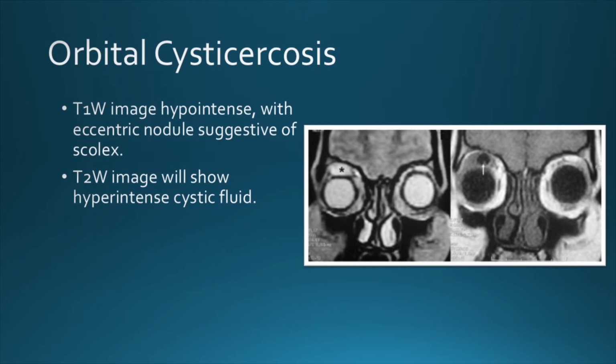Sir, and T1 normal structure will be well appreciated. In T2 weighted images, the pathologies are much more easily appreciable. Sir, it depends on the pathology. T1 is used for anatomy, and T2 will characterize the lesion better. So it will tell you whether a particular lesion is solid, cystic, what is the consistency, what is the composition of that particular tissue.